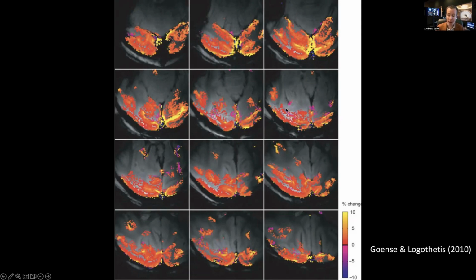This is very high EPI resolution, functional resolution. It gives you a better sense of where the activation hugs the gyri. Now, it's not perfect. I believe this is a gradient echo sequence. It can be a little bit more sensitive to field inhomogeneities. You also can see that within something like the calcarine fissure and extra tissue areas, cerebrospinal areas where there might be draining veins, for example, it can pick up these BOLD signal differences that aren't really the same thing as neural activity. It's farther downstream.